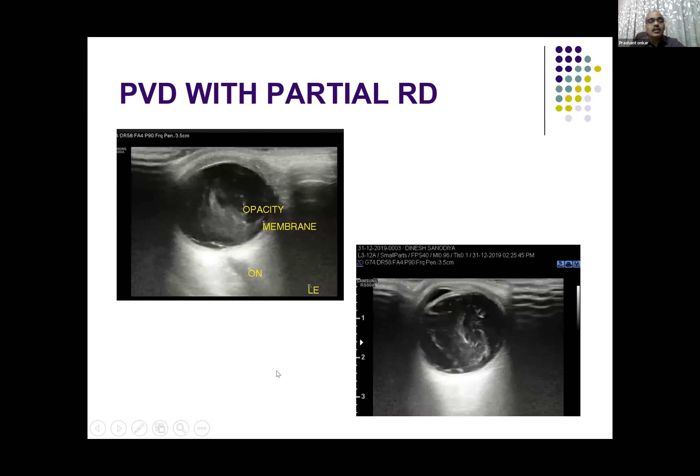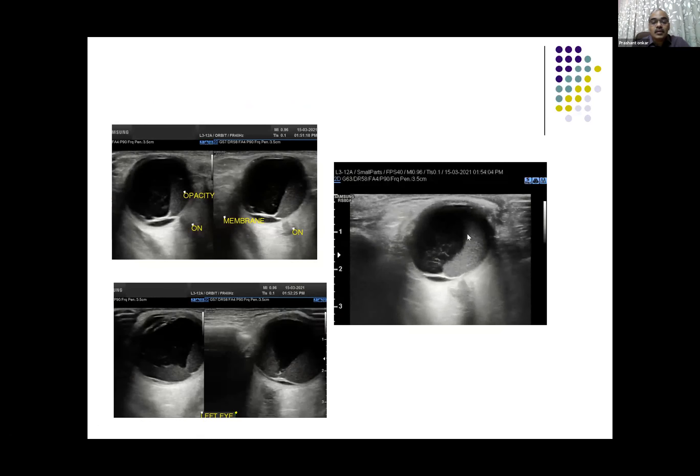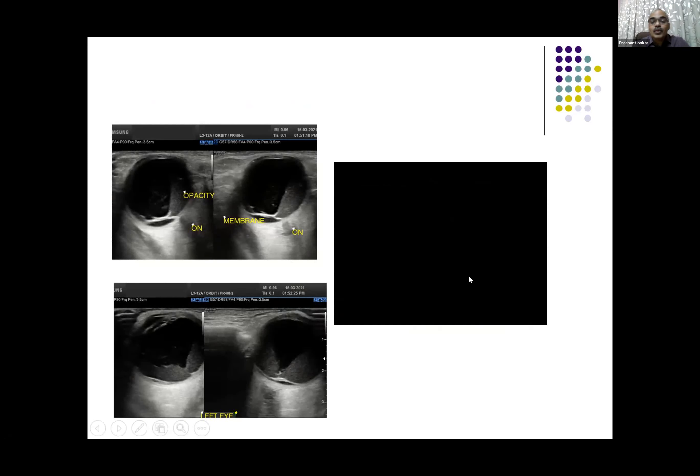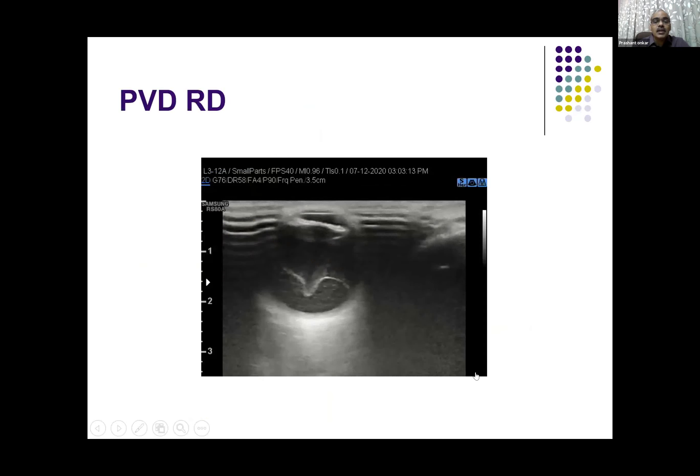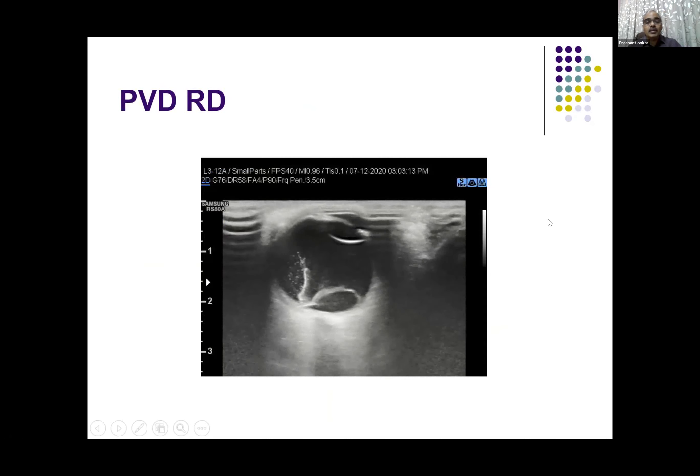This case has multiple pathologies — there is a partial retinal detachment, there is vitreous detachment as well, and you can see that subhyaloid hemorrhage is also seen. So sometimes you can get multiple findings — it is not always that only PVD will be there or only RD will be there. They are interrelated.